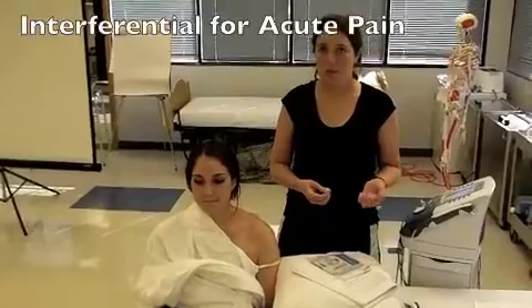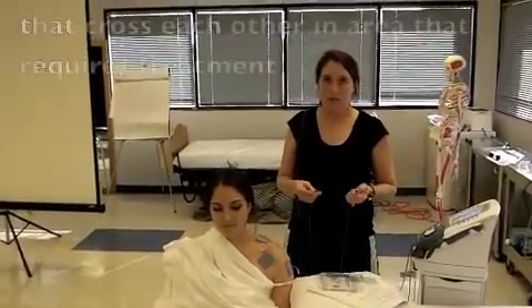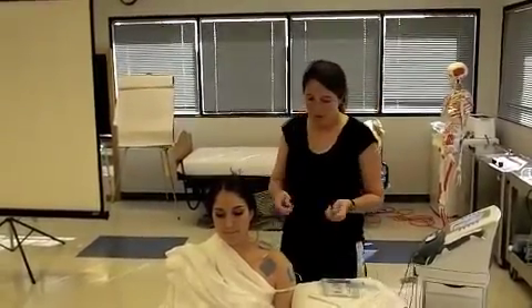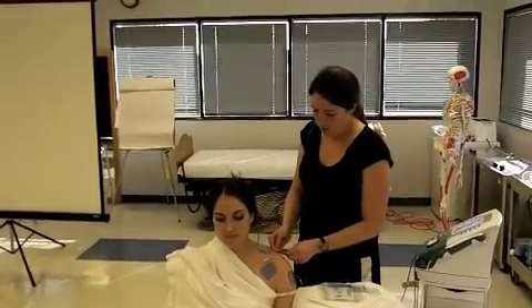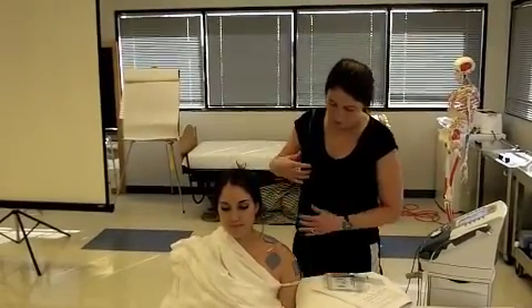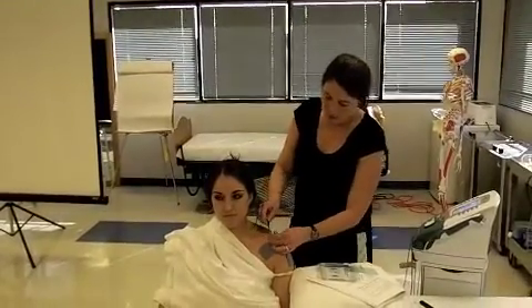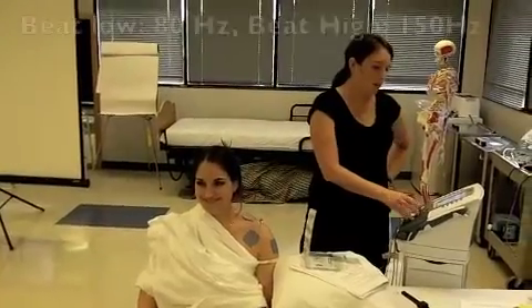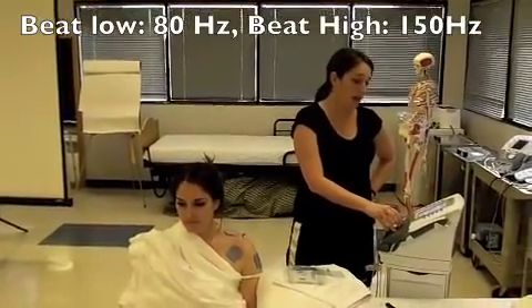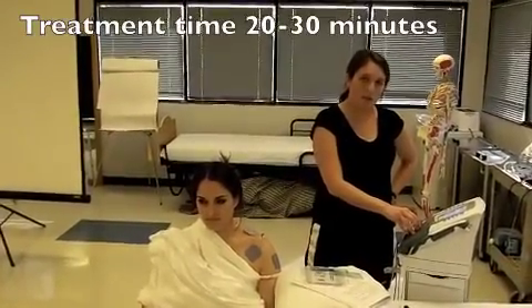Now we're going to do interferential for shoulder pain. Because it's interferential, we want to have two channels — channel 1 and channel 2. On channel 1, we're going to have the two electrodes across from each other, placing them here and here. And then channel 2, we're going to have the two electrodes across from each other, here and here. The frequency for the beat low is 80 Hz, and the frequency for the beat high is 150 Hz, with the carrier frequency at 4,000. We're going to run it for 20 minutes for pain.